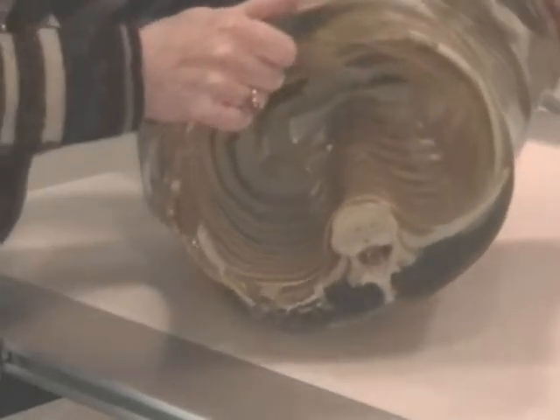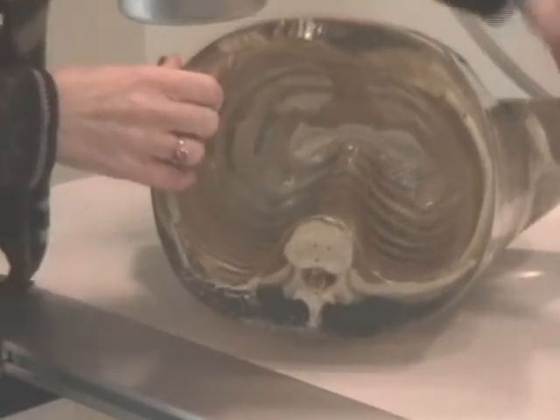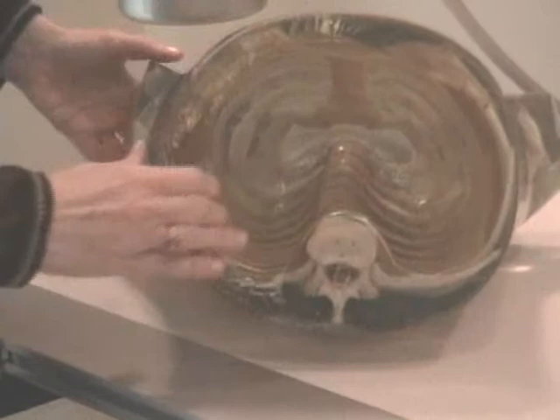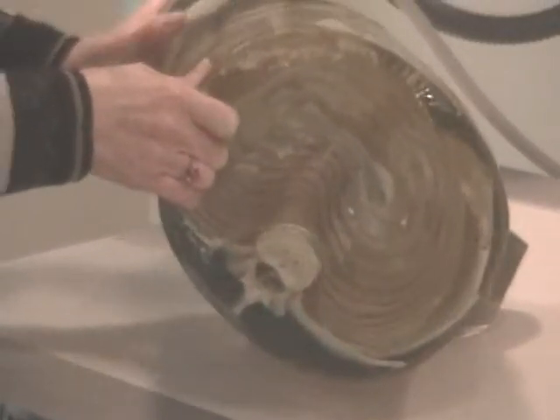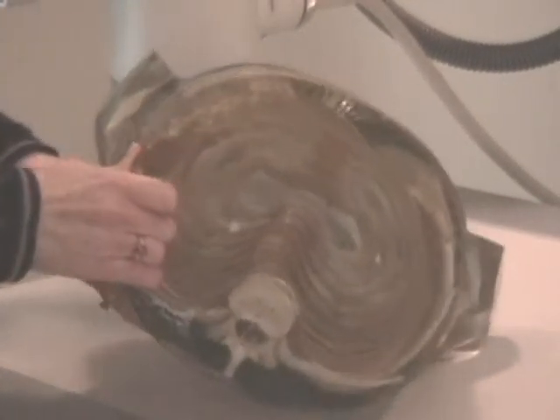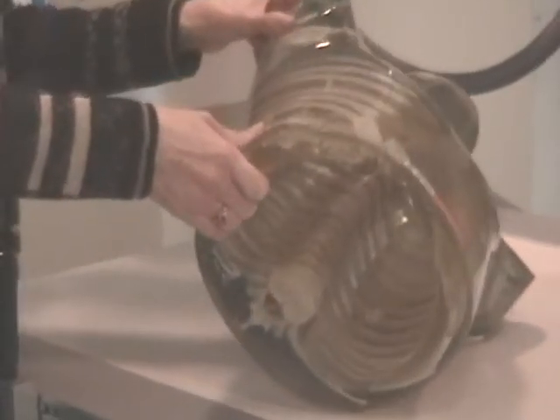If it was a left posterior injury, we would focus on the left side of the patient, above diaphragm, below diaphragm, but the oblique that we would do would be an LPO, like that, because we want to lay out the left ribs and we want the spine underneath the right side.